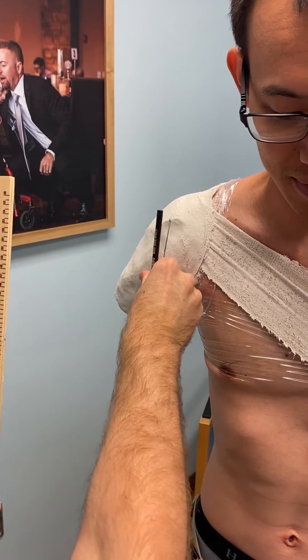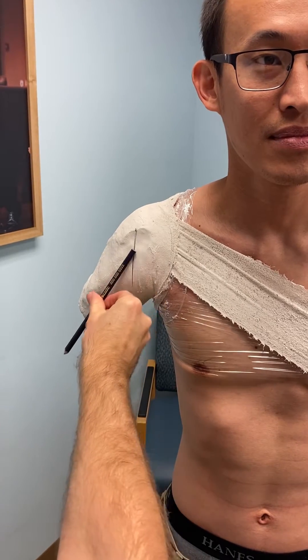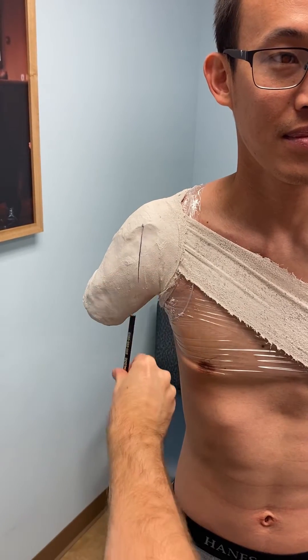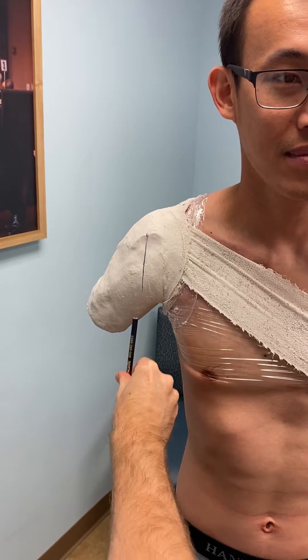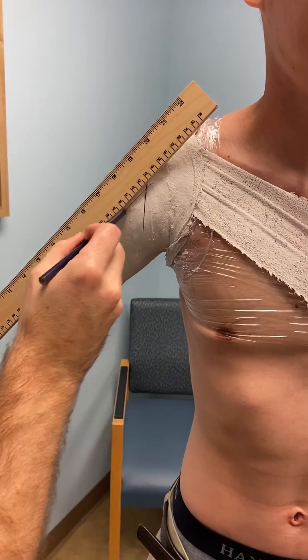We want to mark what's perpendicular with his body for where the elbow is actually going to be, even though his arm is coming out this direction. We want to make sure this is straight up and down, so I'm going to bisect the arm so I know what this angle is.